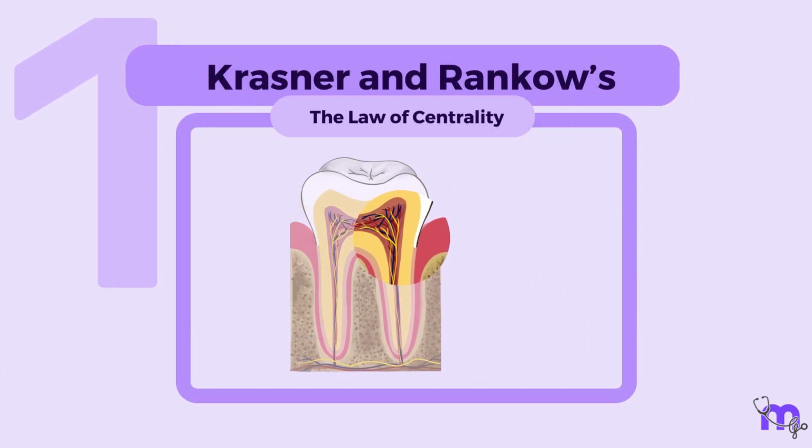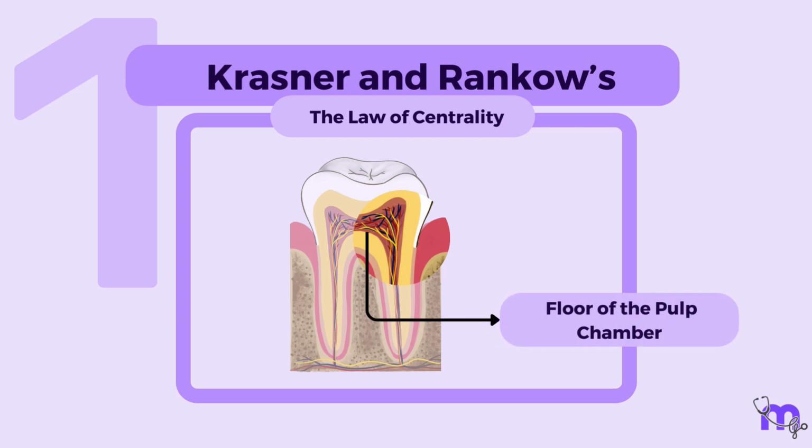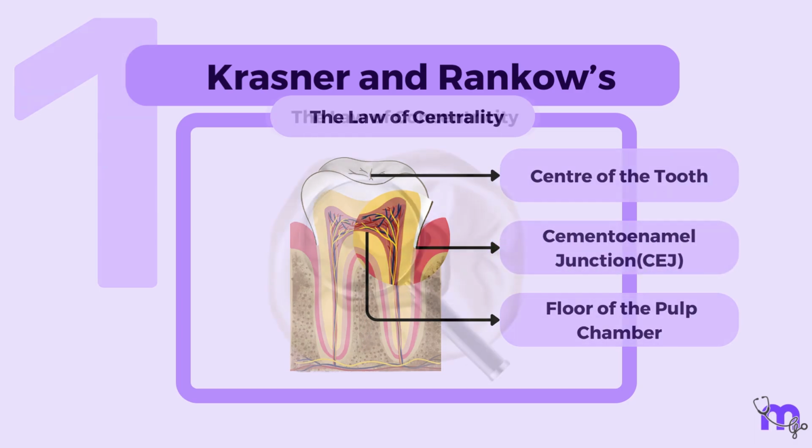The first law, the law of centrality, states that the floor of the pulp chamber is always located in the center of the tooth at the level of the CEJ.